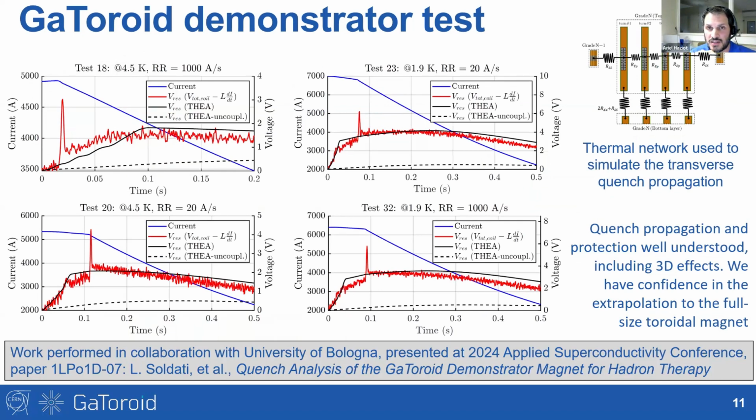We use the opportunity of this test to also validate a full 3D model of the protection. And now we are confident to say that we understand well the protection of this magnet, and we have confidence in the extrapolation of this protection to a full-size system.